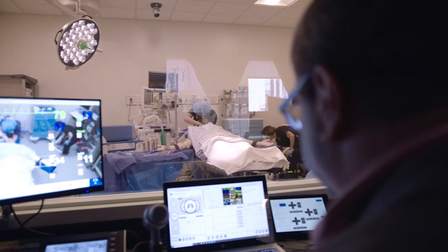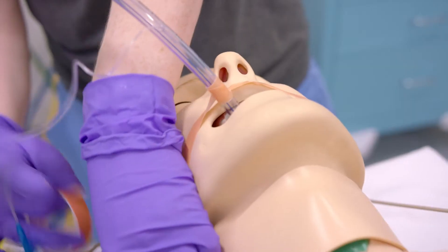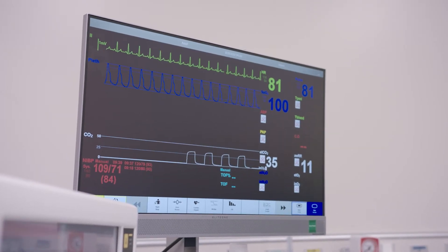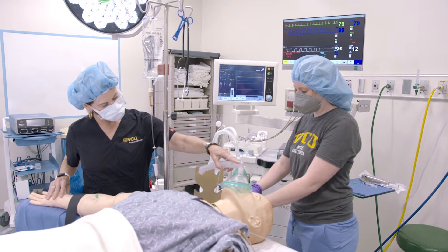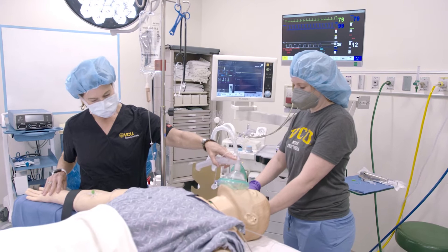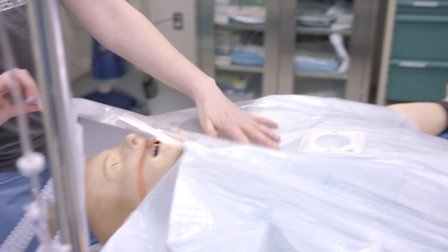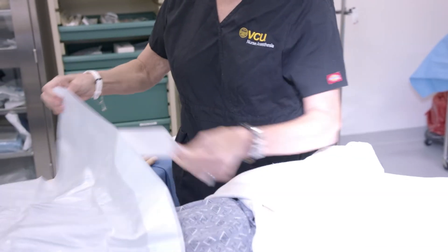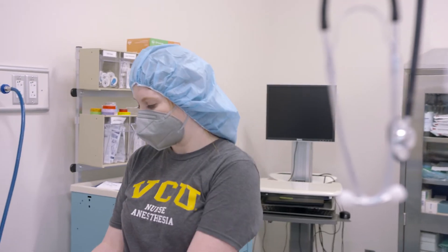Dynamic simulation is where we bring the entire lab to life. There are smells involved and sounds that you would typically hear in the OR. Some of our faculty will play the roles of surgeons, circulators, scrub techs — whatever we need for that time — while the student will participate as the anesthetist.